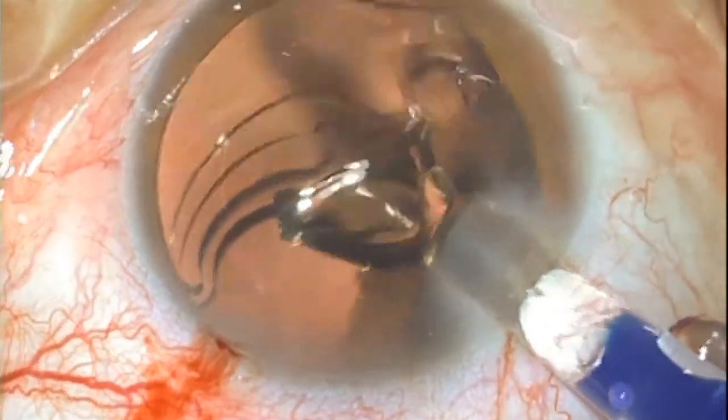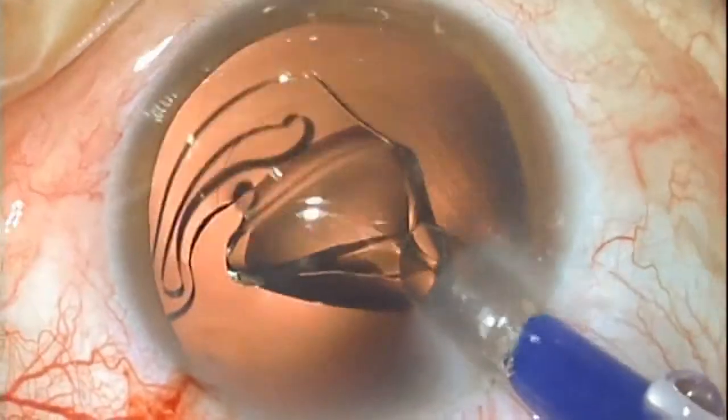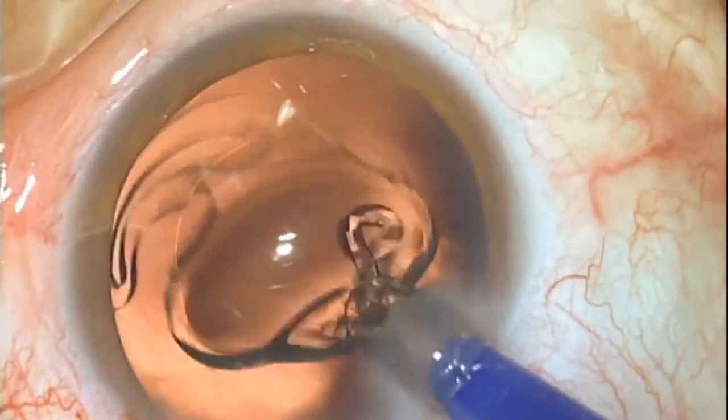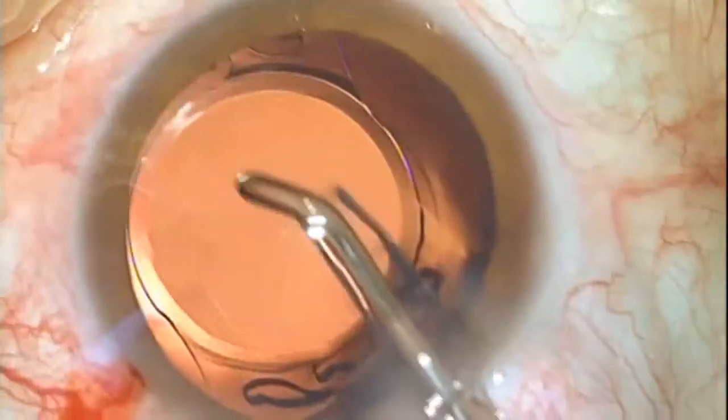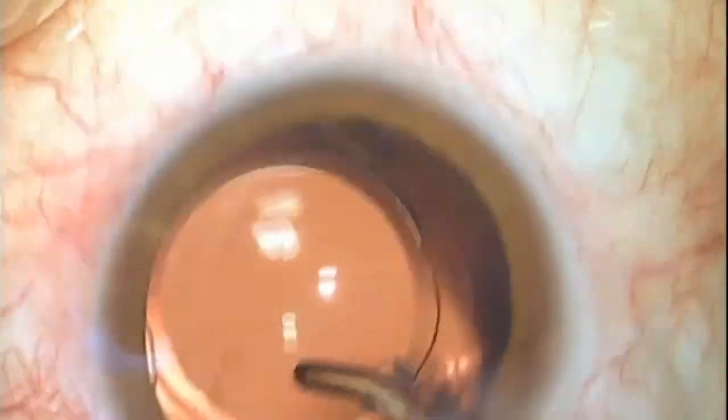Among other positive features, centering is virtually automatic. You insert the lens into the capsular bag, and it positions itself during suction of the viscoelastic gel. With just a few movements, the lens moves into place without any further adjustment.